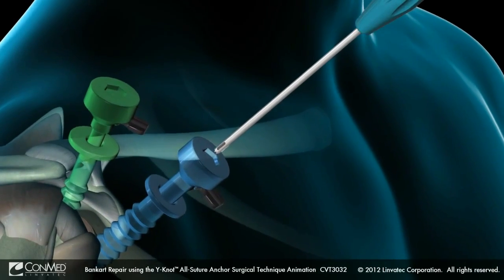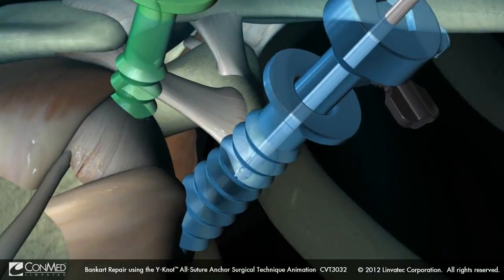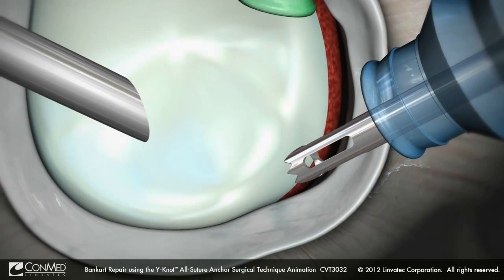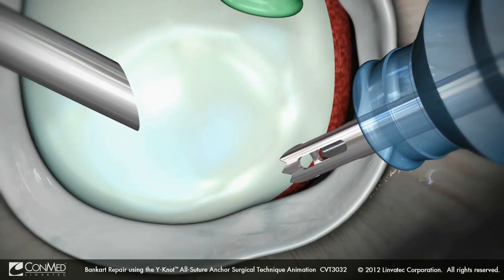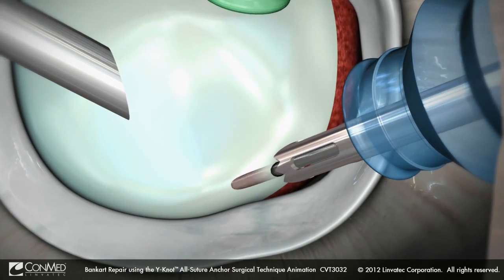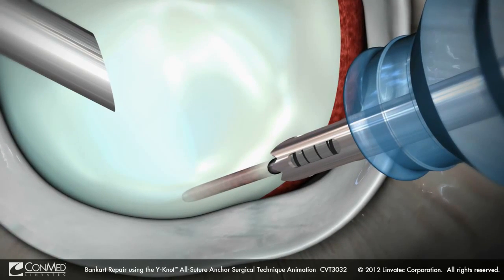Insert the Why Not Drill Guide and position it at the desired location on the glenoid. Note that a light tap on the drill guide will help to seat the guide firmly against the glenoid rim. Drill a pilot hole with the Why Not Drill, stopping when the laser markings on the drill bit fill the distal window in the drill guide.